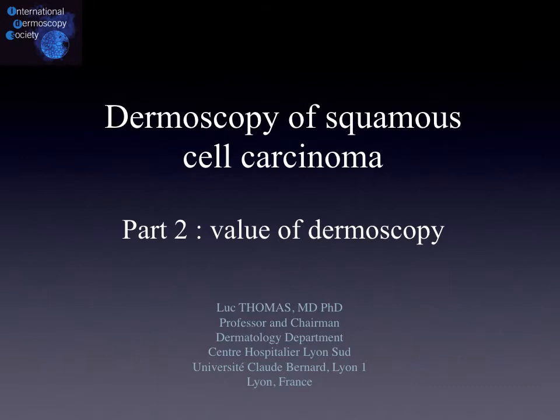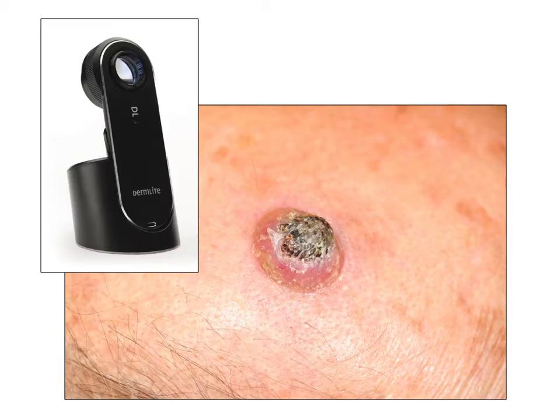Hello again, this is again Luc Thomas speaking about squamous cell carcinoma, and this part will be dedicated to dermoscopy. So what dermoscopy can give you as information in squamous cell carcinoma. First of all, I must say that information is less important and less useful than in pigmented lesions, but some insight can be given and it's interesting to look at it.